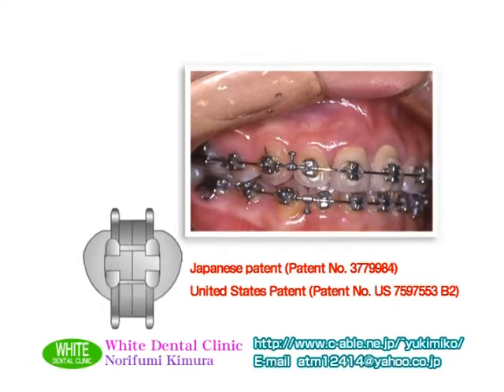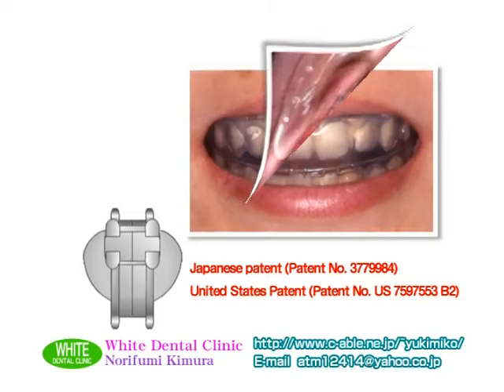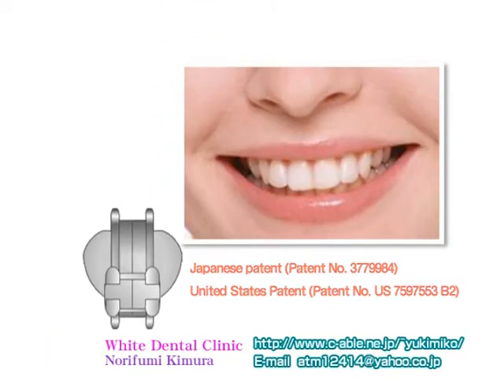I am convinced that commercialization of the slide type bracket will be good news for orthodontists and patients needing orthodontic treatment both in Japan and abroad. I hope that using the slide type bracket allows everyone to conduct more reliable orthodontic treatment without stress.